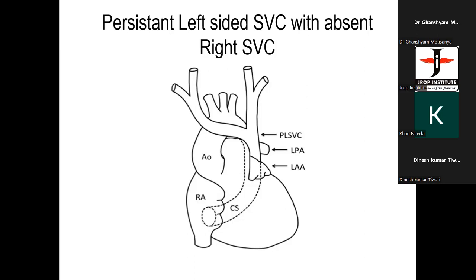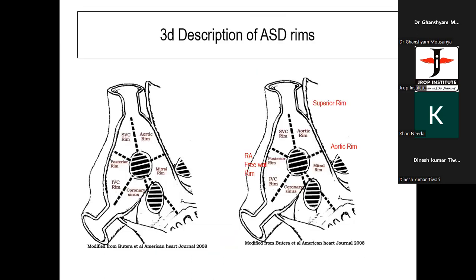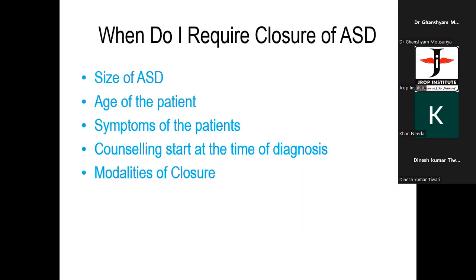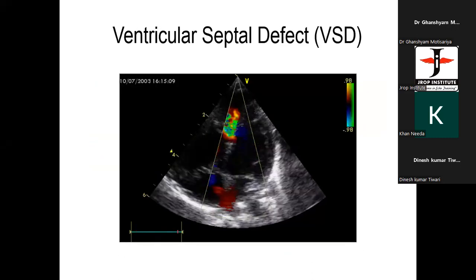First of all, the answer comes in two parts. The basic principle of echocardiography is if you are doing a Doppler, you should be parallel to the flow. If you are doing imaging, you should be perpendicular to the flow. In the four-chamber view, we are almost parallel to the interatrial septum.